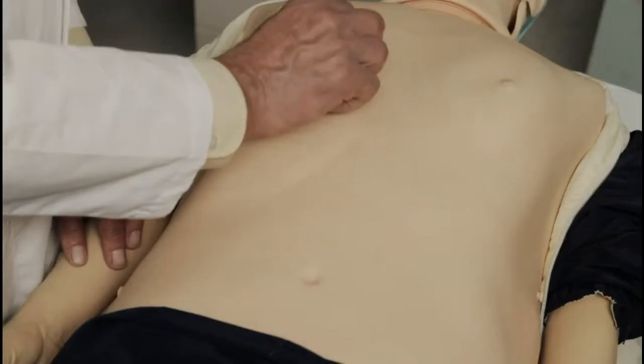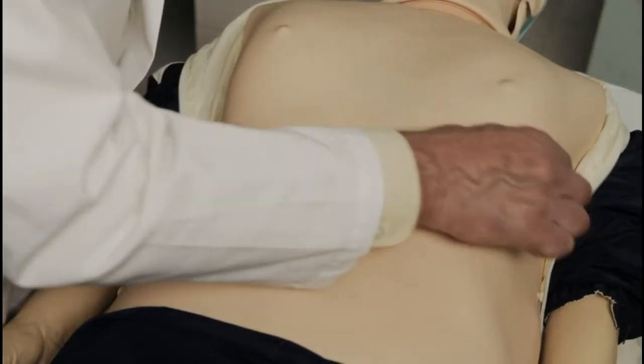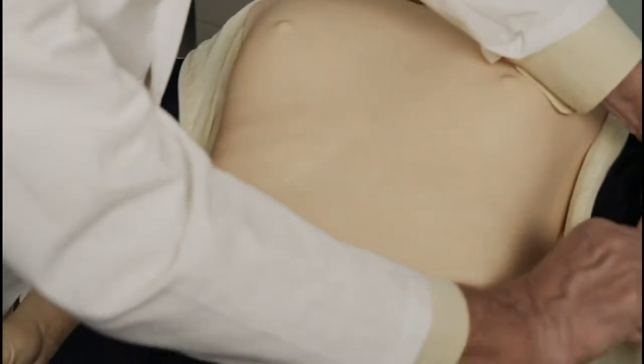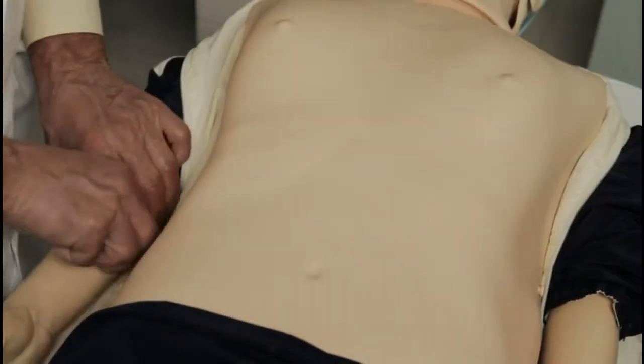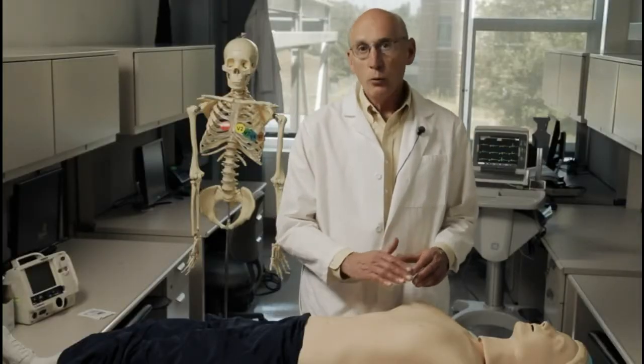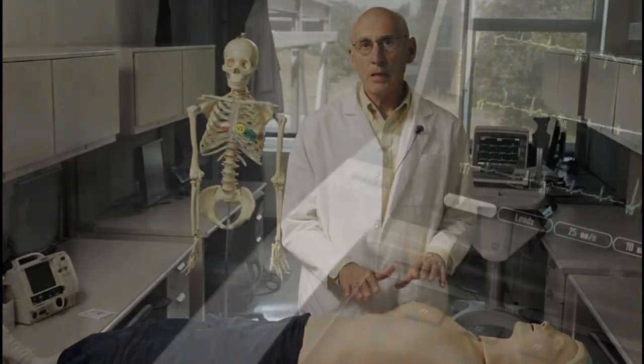Now a word about skin prep. If there is excessive chest hair, use a razor blade to remove it. Wipe areas on the chest and the inner surface of the arms and legs with an alcohol pad, and after that dries, rub it a bit with a gauze pad. The skin must be rubbed to remove oils, dirt, and loose skin in order to improve the ECG tracing.